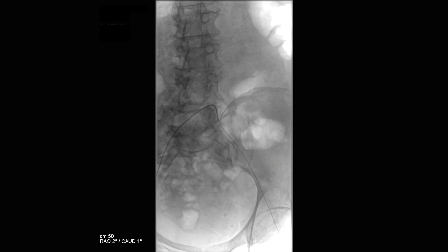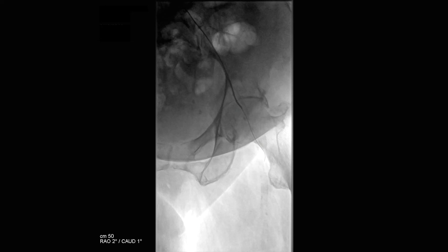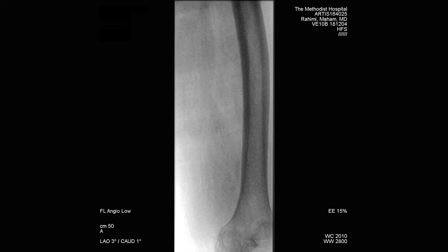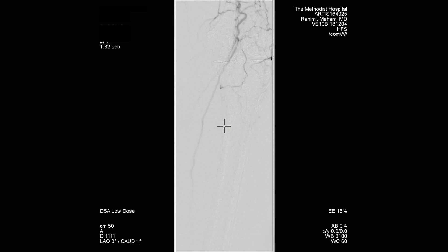The catheter is then carefully advanced over the wire in order to selectively catheterize the left common iliac artery. From here the catheter is advanced into the left common femoral artery and DSA is performed in order to visualize the common femoral artery, the superficial femoral artery, and the profunda femoris artery. The image intensifier is then advanced distally to visualize the distal SFA and the popliteal artery, then further down to visualize the anterior tibial artery and the tibial peroneal trunk including the peroneal artery and the posterior tibial artery.